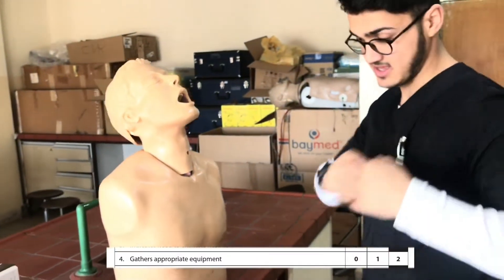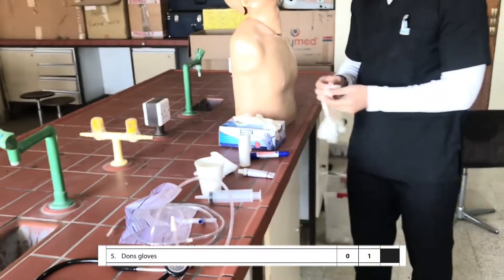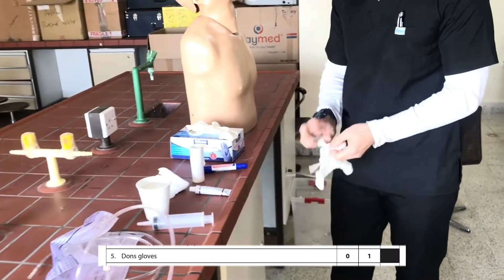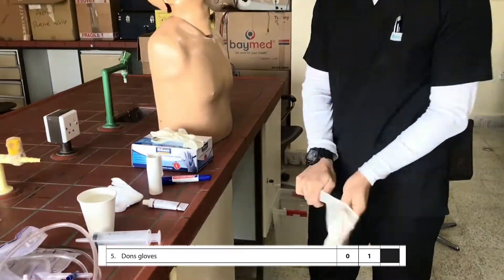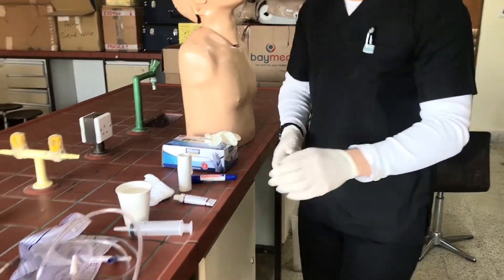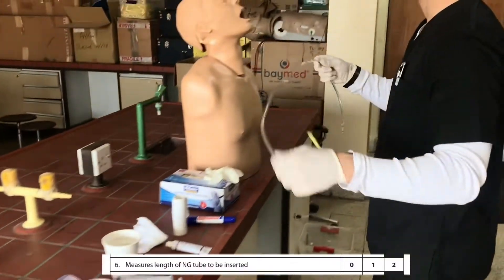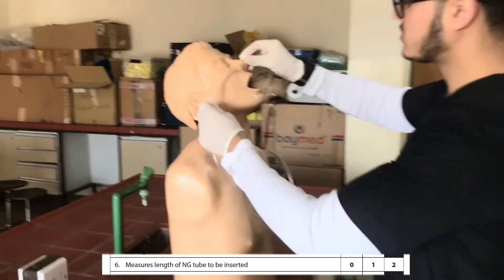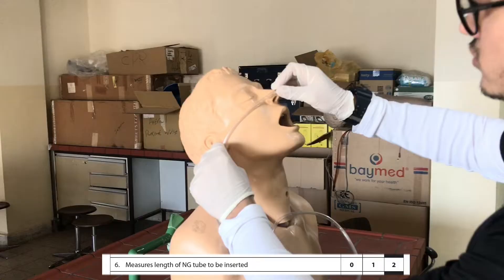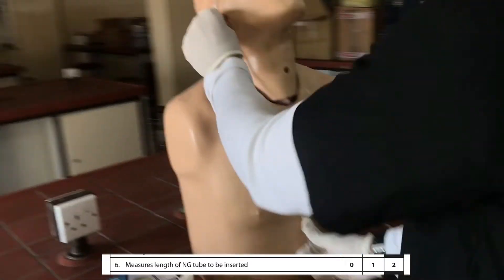Then I gather my equipment and put on the gloves. Then I measure the length of the tube, which starts from the tip of the nose to the earlobe, and from the earlobe to the xiphoid sternum and five centimeters below.